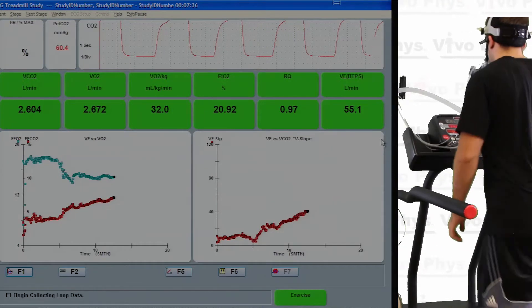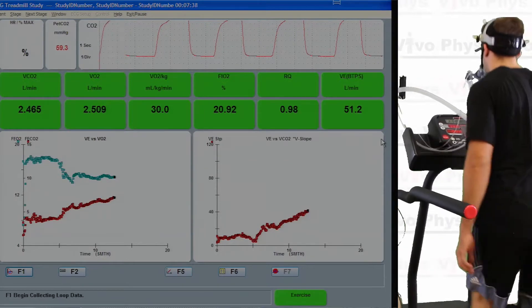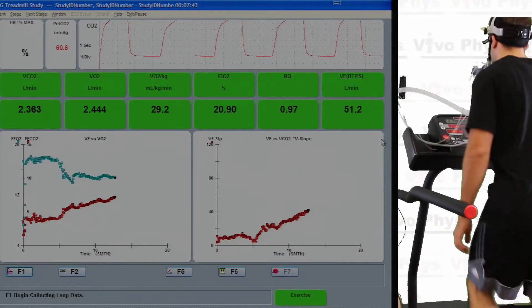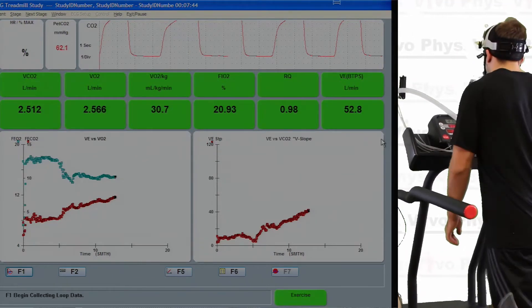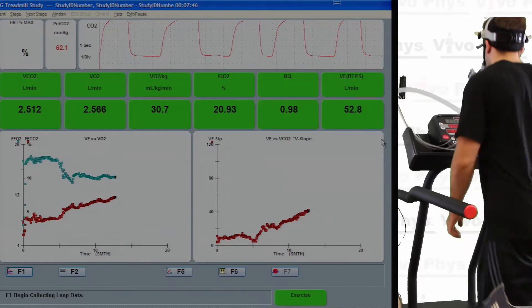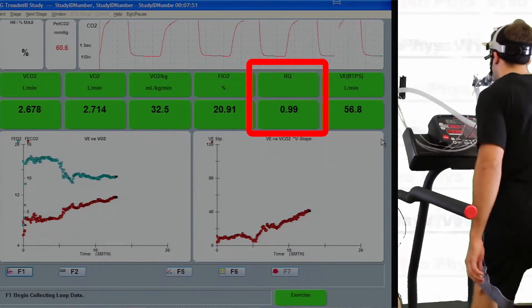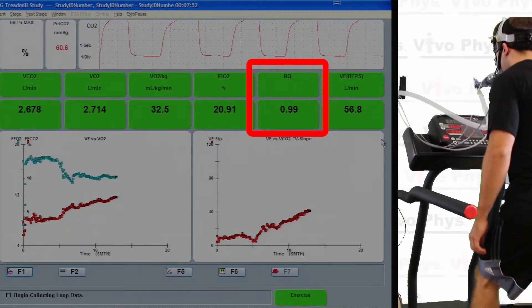For most people, a test like the Bruce protocol is fairly simple at the beginning, at least for an average reasonably healthy person. But at some point, if you watch the RQ or RER value, it's going to start to press over one.